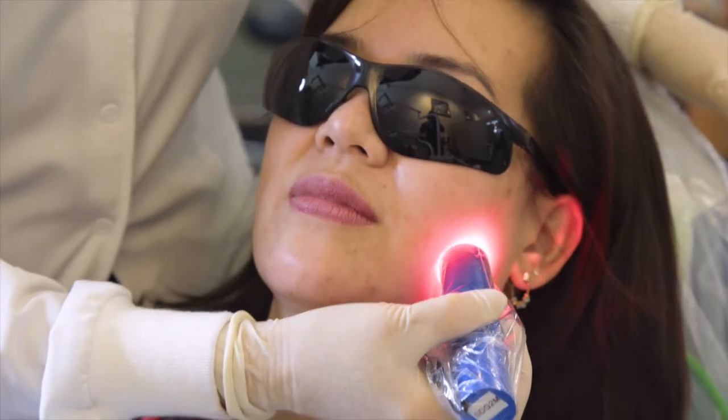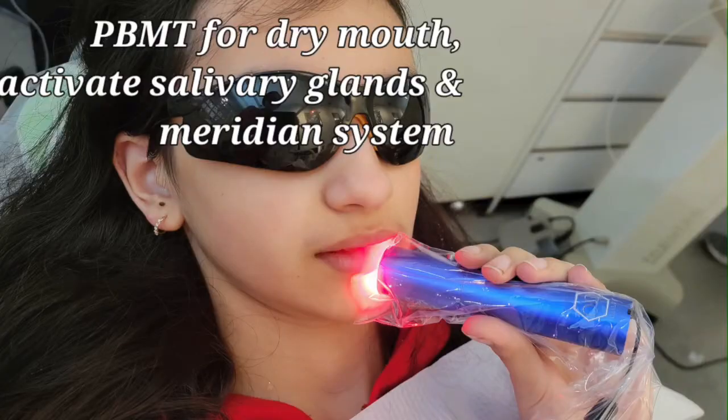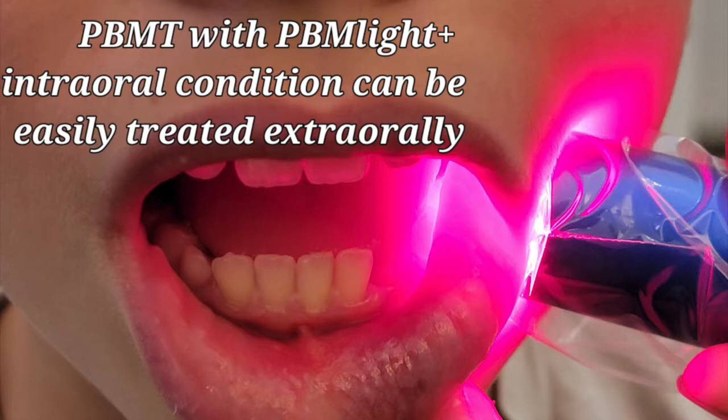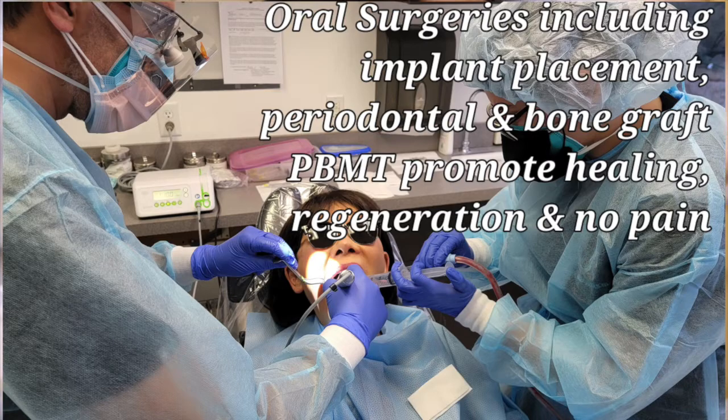We can also treat periodontal problems or prophy cases easily. We treat intraoral conditions extra-orally because the light penetration goes in about four centimeters deep, allowing the light to actually reach the intraoral structures we want to target.